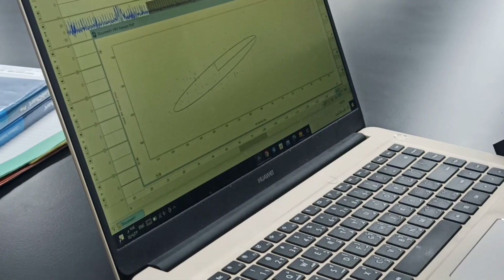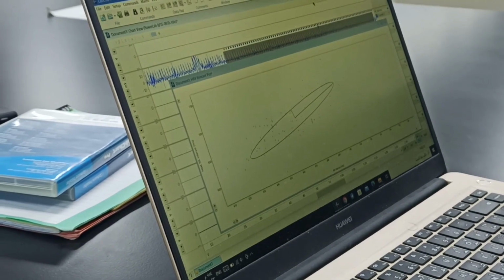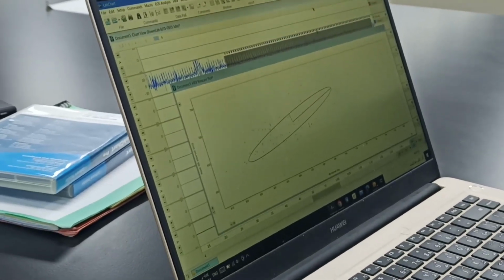This also gives you a scatter, showing how much the beats are varying from each other. So this is a graphical form, and it immediately gives you the idea, oh, it is very scattered. So without going into actual figures, you get the idea. All right, so Poincare plots we will be also dealing with.